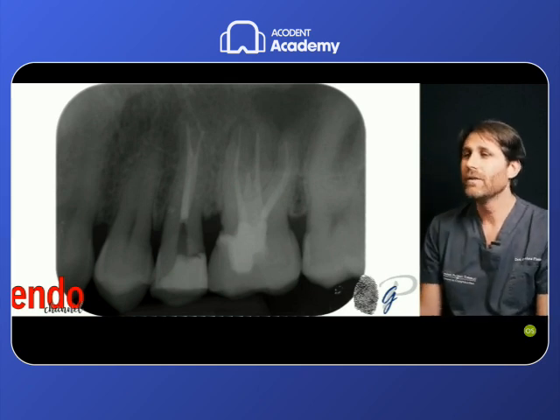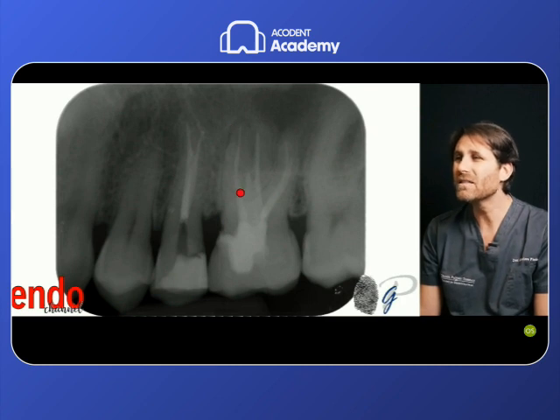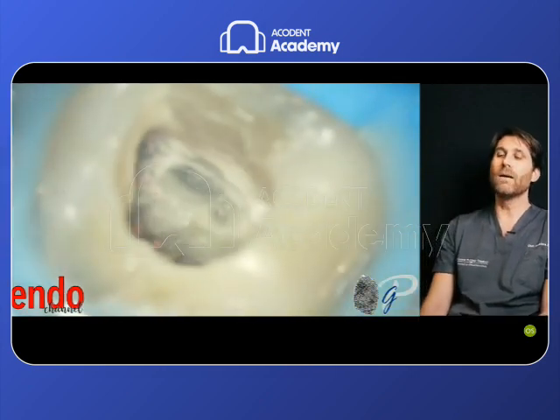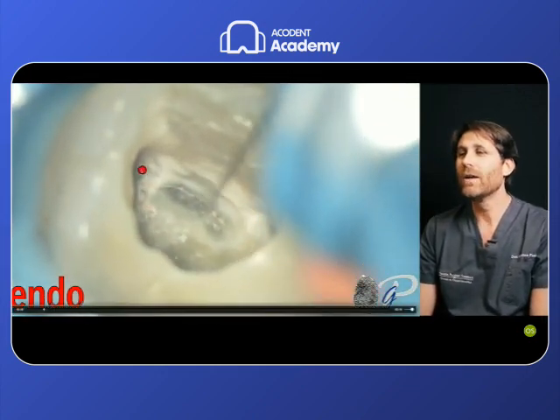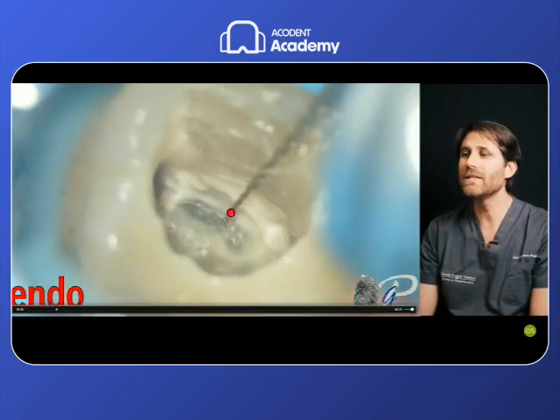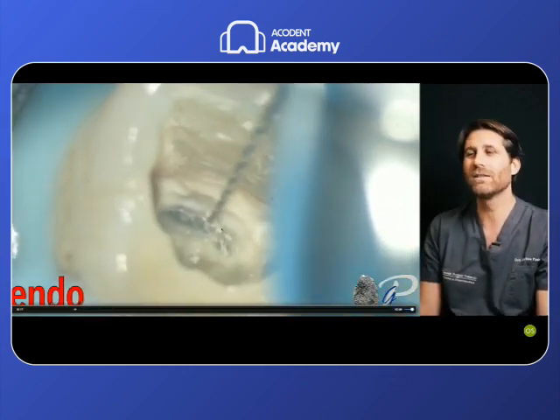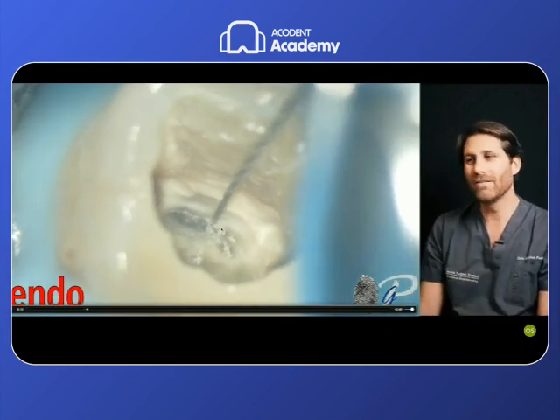Another case, this upper molar retreatment, 1, 2, 3, 4, 5, it seems there is strange anatomy. Let's have a look at the internal anatomy of this tooth after we reopened the access cavity. We went with the ultrasonic troughing through the isthmus. As soon as we found an orifice, this was a non-treated MB2 root canal in a retreatment. That means that probably for me it's the easier root canal because the other colleagues have not touched this root canal. So it's a primary treatment for this root canal.